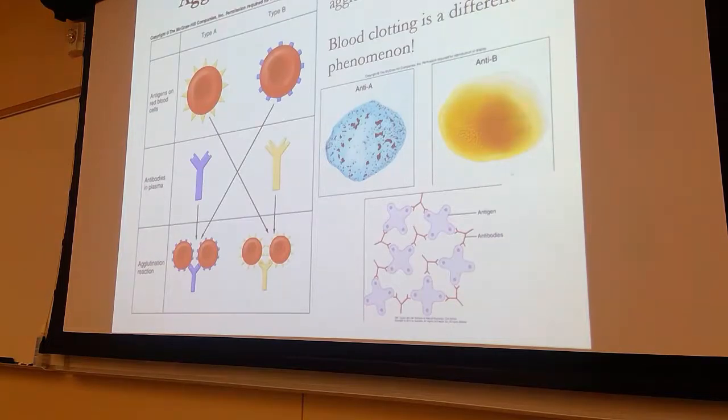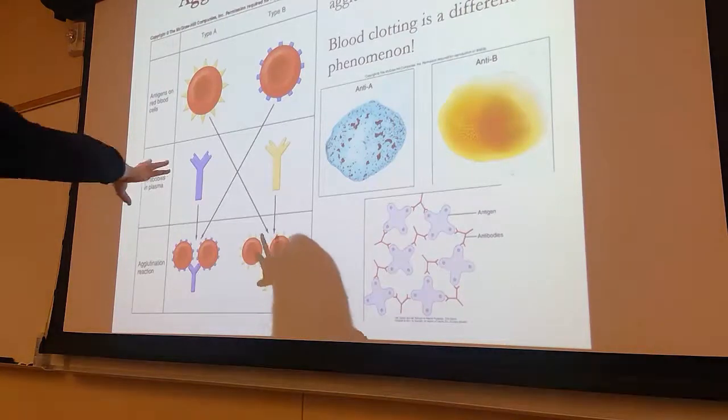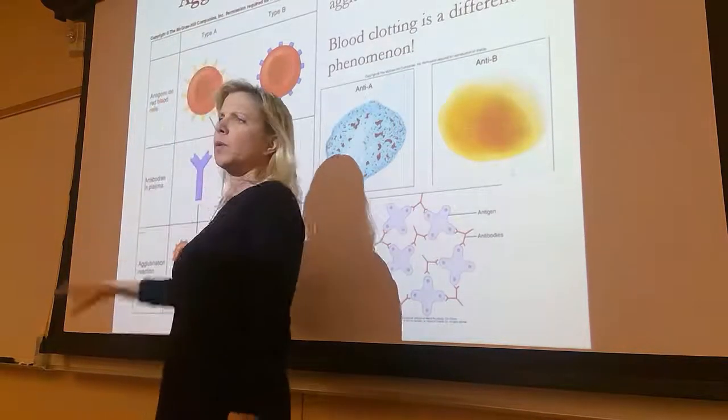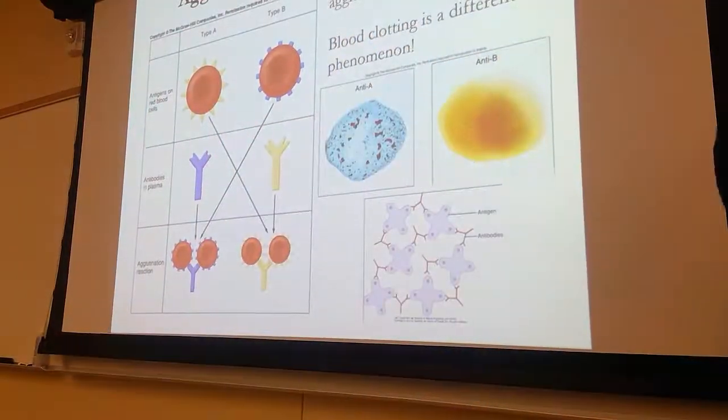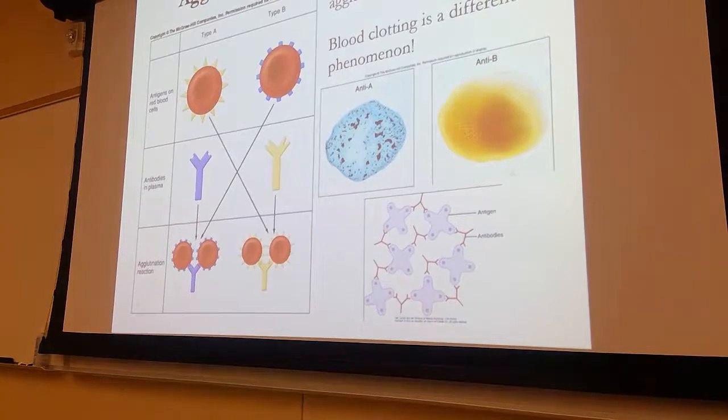It is important that we recognize that there are antibodies in our plasma, but when we blood type someone, we're adding antibodies to their blood. Little drops on a slide. We even do it on a card at a mobile unit.